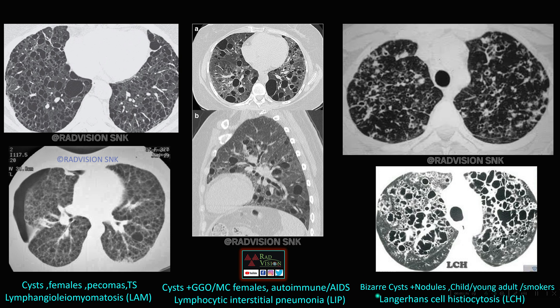Another similar picture shows multiple cysts of varying sizes which are bizarre-shaped, predominantly in the upper lobes, in a child or young adult smoker. Here you can see multiple intervening nodules, and sometimes these nodules cavitate forming cysts; honeycombing appearance can also be seen. This is Langerhans cell histiocytosis (LCH). To summarize: simple multiple cysts with pneumothorax in a female — LAM; multiple cysts with intervening GGOs in a female — LIP; multiple cysts with cavitating nodules in a young smoker or child — LCH.